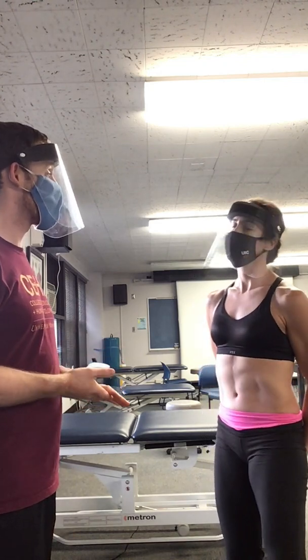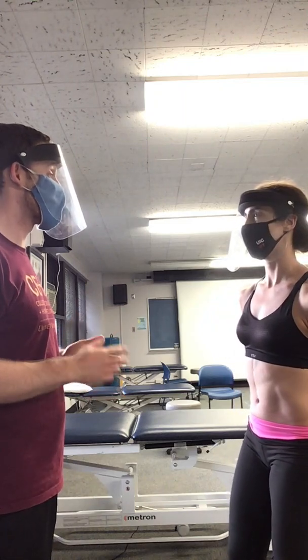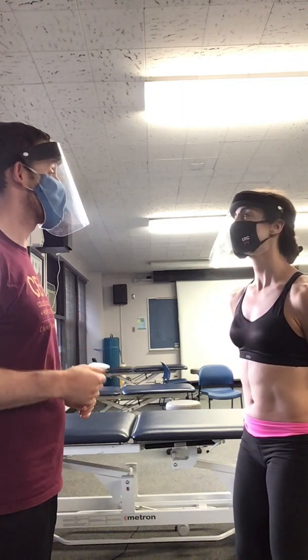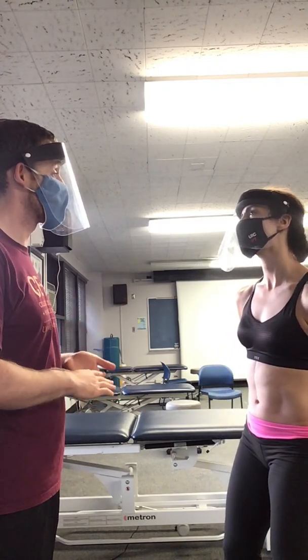So Jenna, what I'd like to do today is take some assessments on your spine, see how well you bend side to side. That'll give us an idea of what the next step is in your treatment plan. It's going to involve me putting some pieces of plastic on your back and measuring how well you're moving. Does that sound okay?